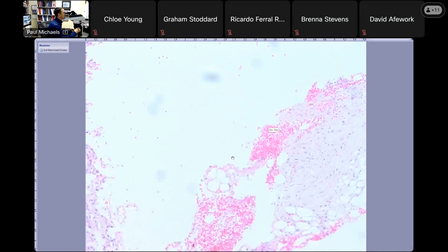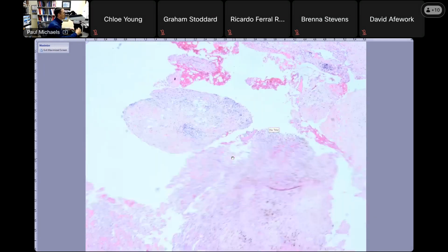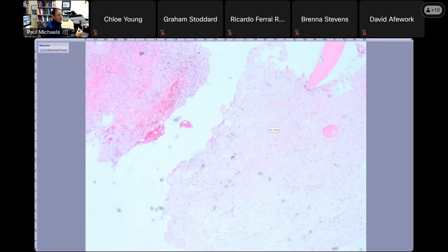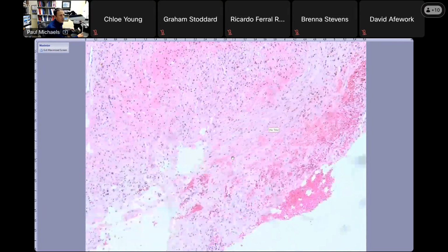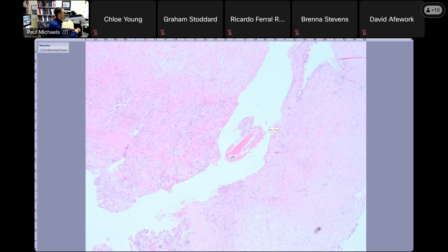This is the K, so this is kidney. Now, kidney in the bone, usually there's a history, but I am telling you, you better be careful with these because it's very easy to miss, because most of these are clear cell. A lot of clear cells are just hemorrhagic, and it looks like there's fibrin. So it's one of those things like angiosarcoma. You're at low power, and you're like, oh, that's just a lot of blood. That's just a lot of fibrin. Let me show you.